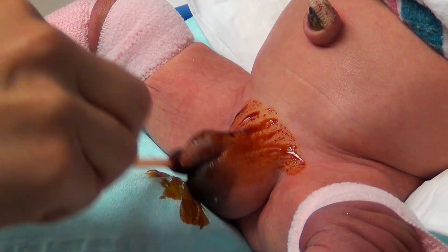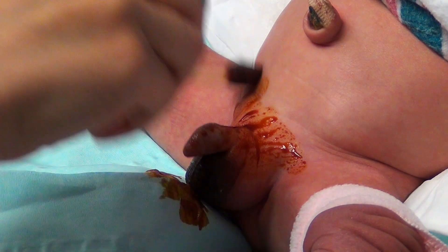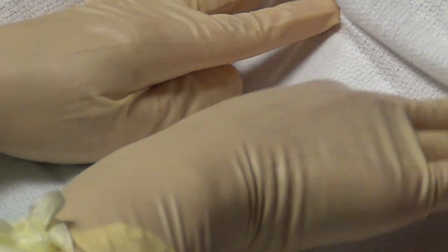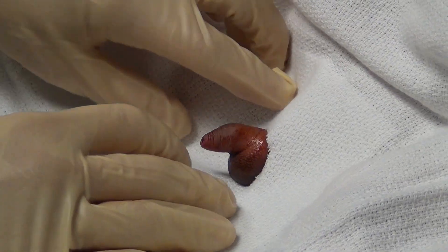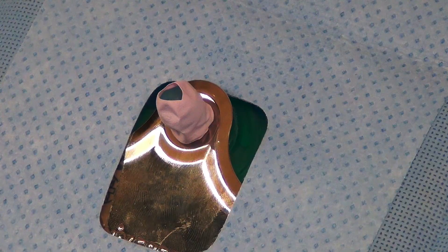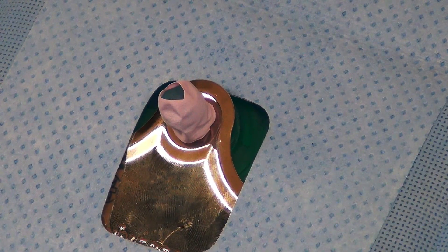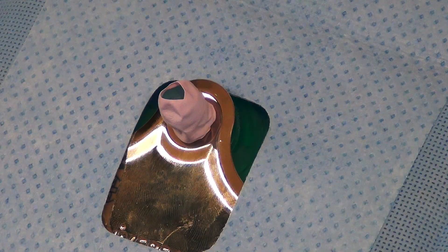After allowing time for the nerve block to set up, the penis is then prepped with betadine. The procedure site is then draped with sterile towels. In the rest of the video, we will use the model to simulate the various techniques for neonatal circumcision.